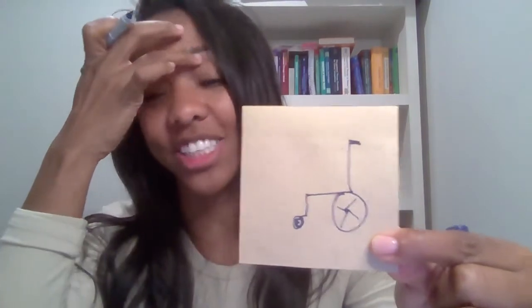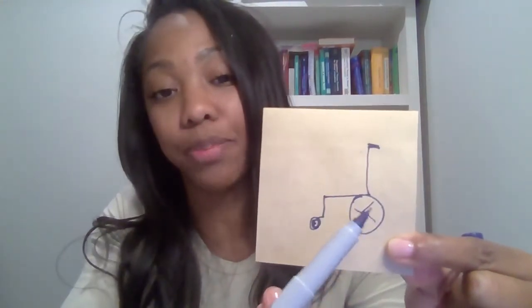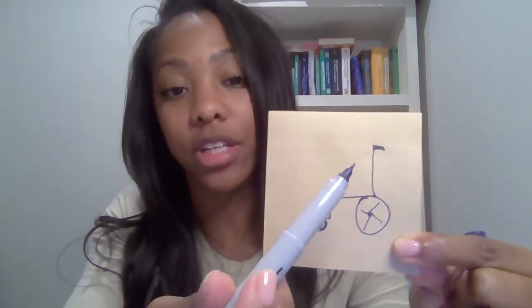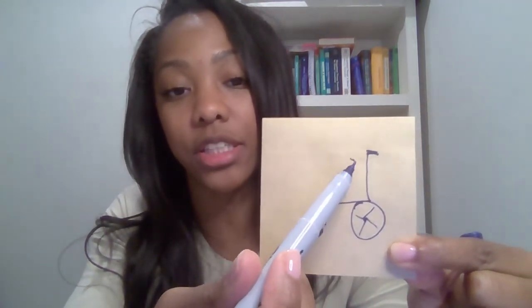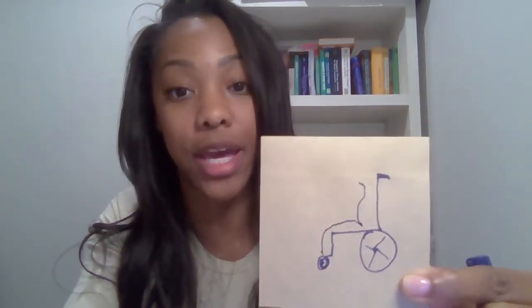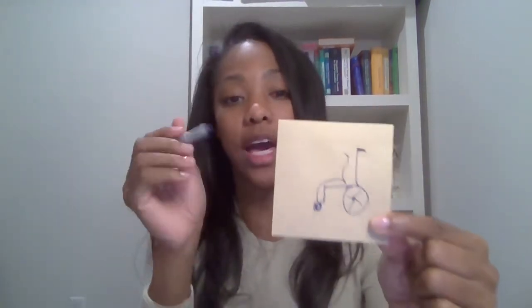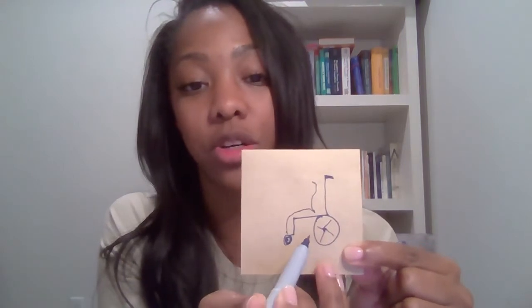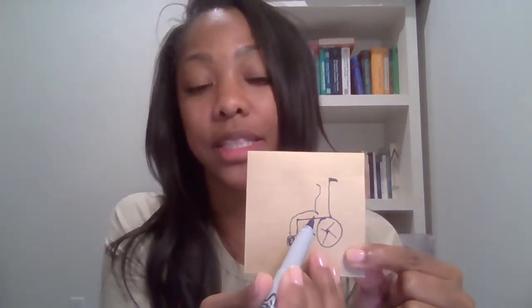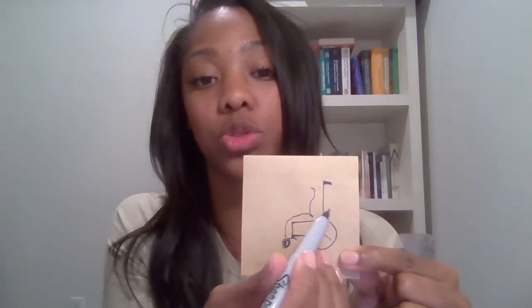So we have a wheelchair, right? And again, we have the big drive wheel and we have our small casters. And your client's center of gravity, when they're sitting in a chair, they're right here chilling, relaxing in their chair, okay? So if I move this drive wheel anterior, that means that the client's weight will go to the back of the wheelchair. So let's see what that looks like, okay?